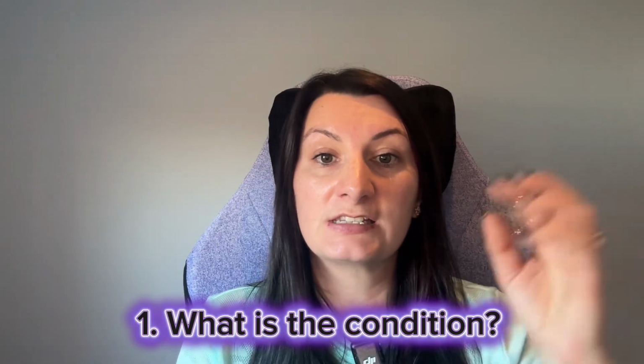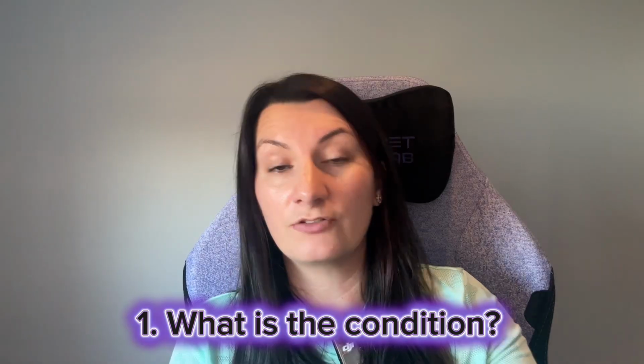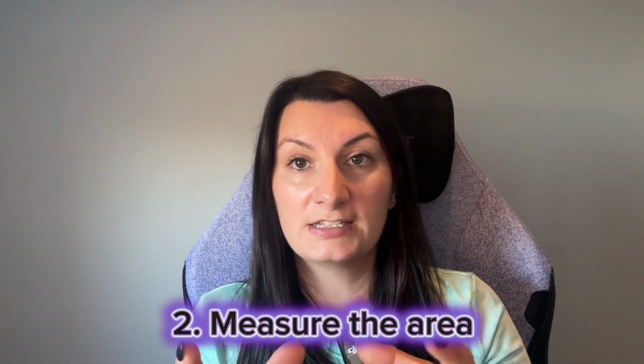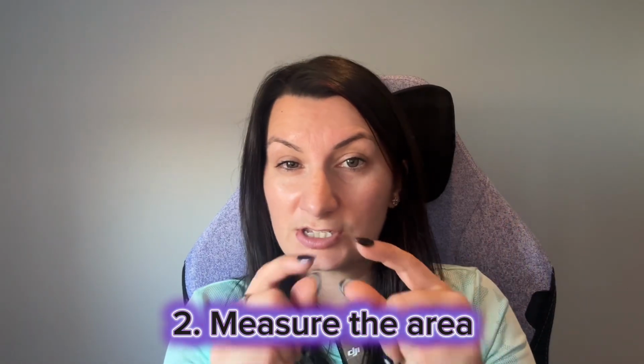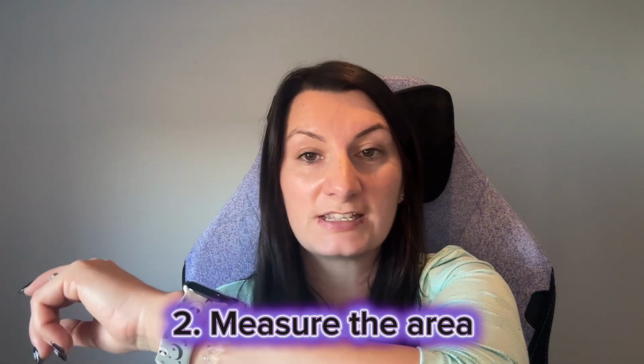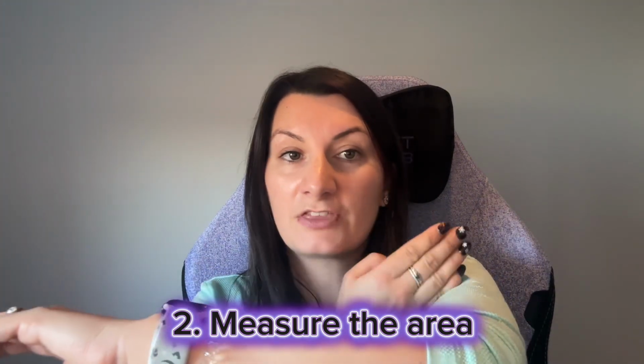So there are 4 stages to calculating your dose for your treatment. The first stage is to determine the condition that you intend to treat. Second is to determine the size of the area that you're going to treat, and that's often not just a small area. For a joint, it's 360 degrees, a third above, a third below.